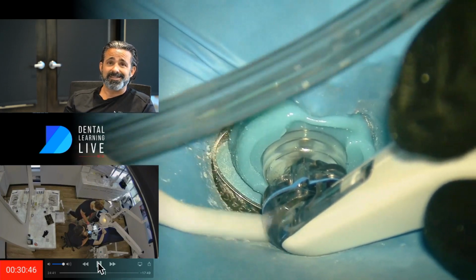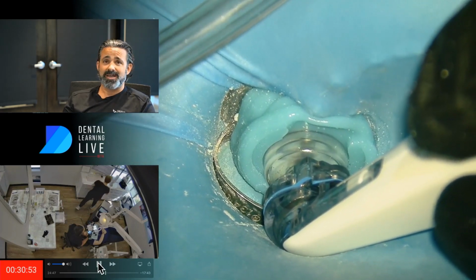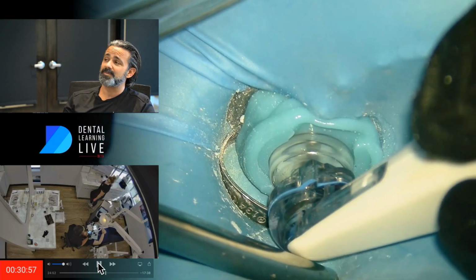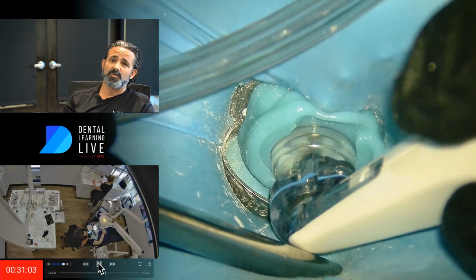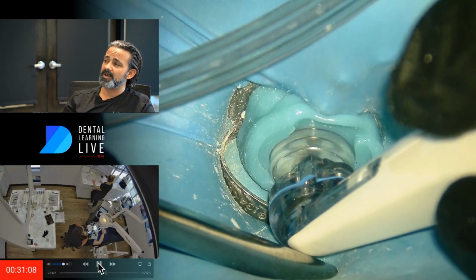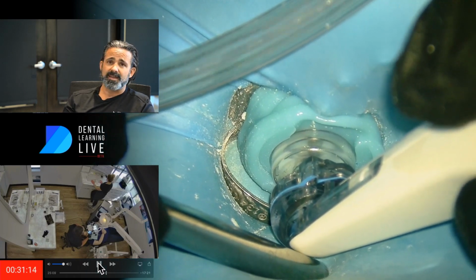Again, I'm banking on this root canal being different than the previous root canal. I don't want to do the same root canal twice. It failed. It had a lesion develop post-treatment. And what I gathered from the patient on this case is it was actually a hyperemic vital case to begin with. So this is something that developed along the way over the time course of that previous root canal treatment. So we've got to find something here, and that's something that can be found.